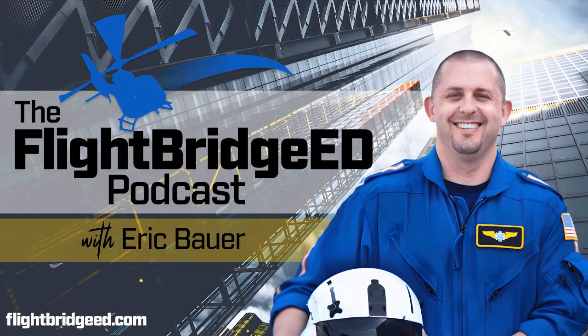I guess what I'm saying is PEEP is going to do so much for you, and you kind of have to weigh the pros and the cons. PEEP is going to be the quickest way to increase oxygenation. Remember in my first podcast where I talked about the glass door and the alveolar membrane and how we want to make that glass door bigger. We want to reach those dependent lung fields. We want to spread that out. And so make that glass door bigger, make it clean, and you're doing that by increasing somebody's PEEP, okay? I will say that most people will respond very well to 8 to 10 of PEEP. Most times you don't need to go above that. The patient that you're going to have to go high on your PEEP to oxygenate is going to be the ARDS patient. But we'll talk about that here in a few minutes.